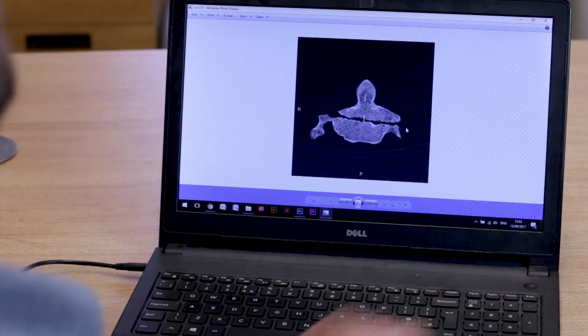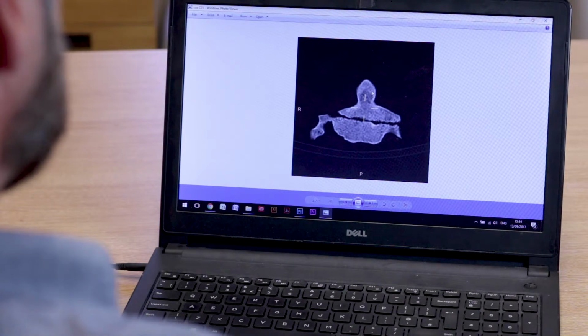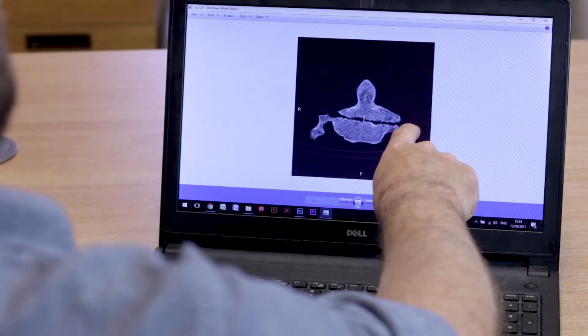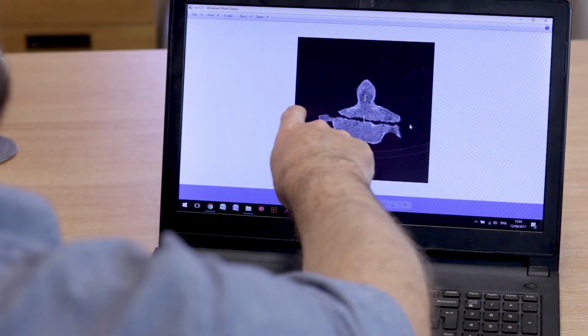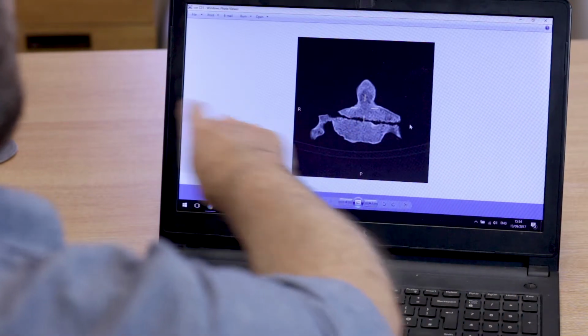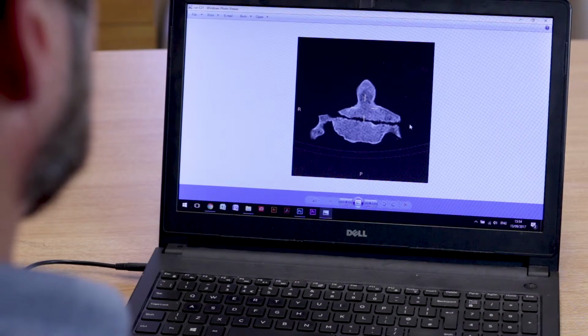And this time we've reconstructed in this direction, so it's like a slice coming down like this through just one of the bones at the very top of the neck. It's the second one down, in fact, and here we've got this cut across the bone, so a very strong blow with a blade has cut straight through the bone and cut the head off this person.